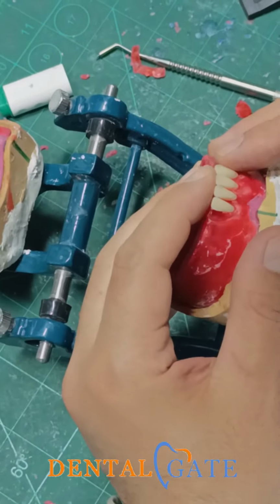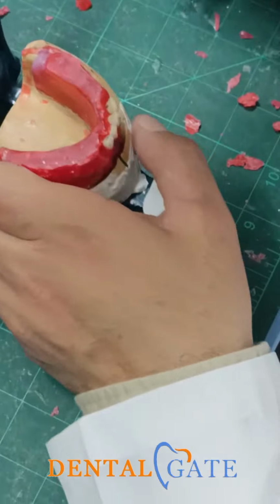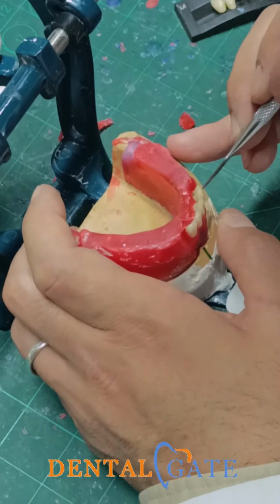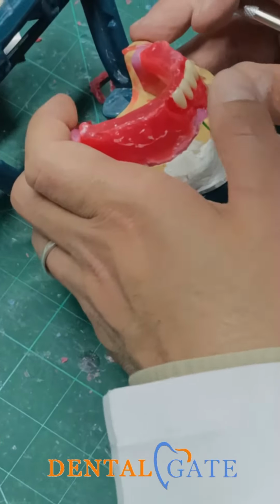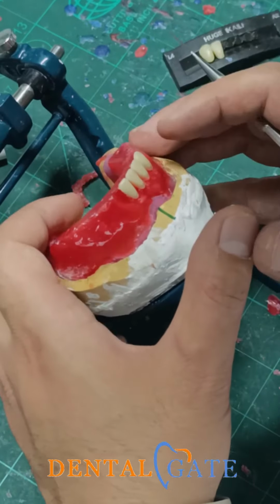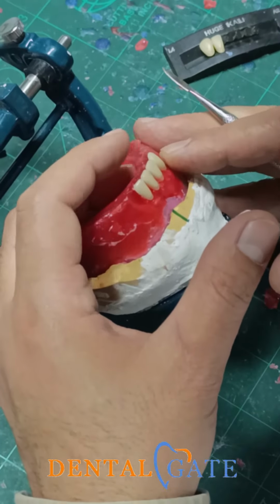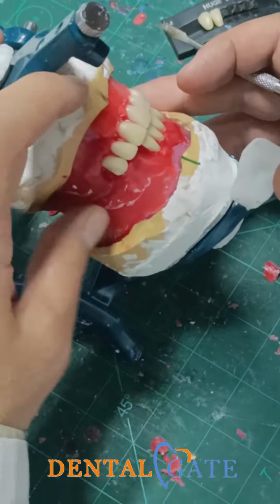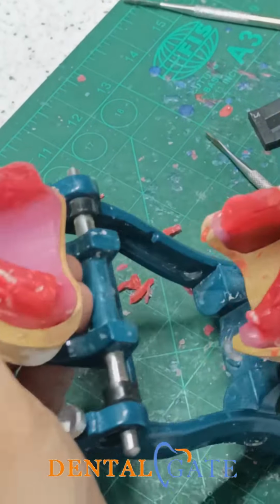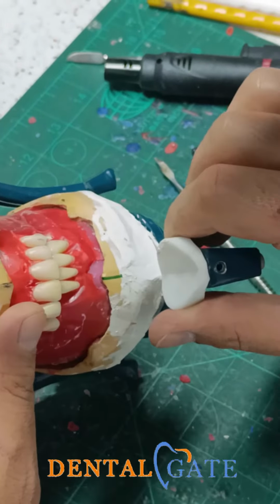And now, regarding the curve, please, with the same criteria in the upper, I will start my posterior teeth within this corner. So we have two aspects. This aspect will represent the anterior teeth, and we will make a rotation to start to make a curve in the posterior. Okay? Now I will make a correction to the upper canine to provide the same thing.